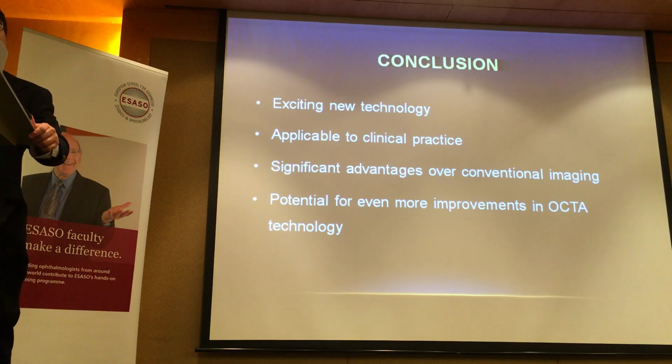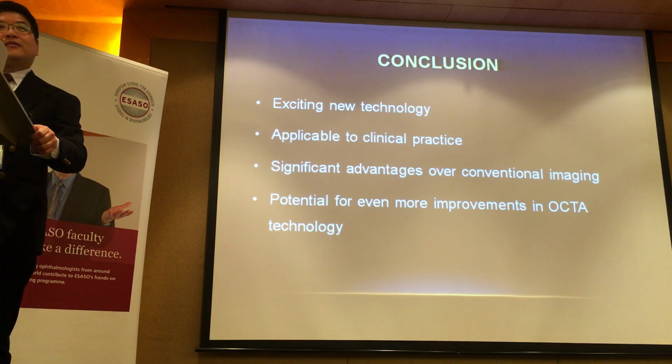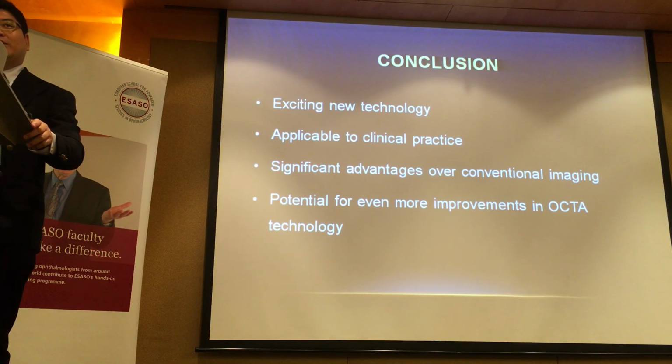Usually the OCT that is associated with the OCT-A is of very low resolution. So in your clinical practice, do you always have the HD OCT done first and then you progress to the OCT-A, or do you totally rely on the OCT-A? Yeah, good question. No, I would not rely on the OCT-A alone. I would definitely want the typical spectral domain or swept-source OCT, the structural OCT as it were.